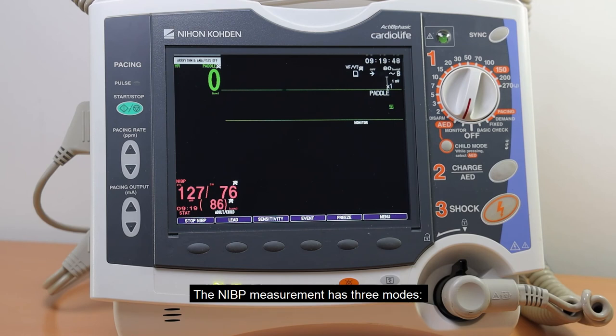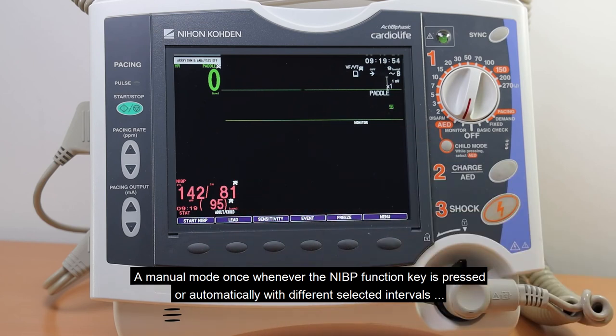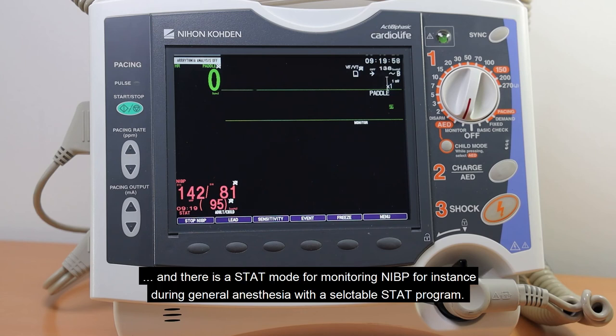The NIBP measurement has three modes: a manual mode triggered whenever the NIBP function key is pressed, an automatic mode with different selectable intervals, and a STAT mode for monitoring NIBP — for instance during general anesthesia — with a selectable STAT program.